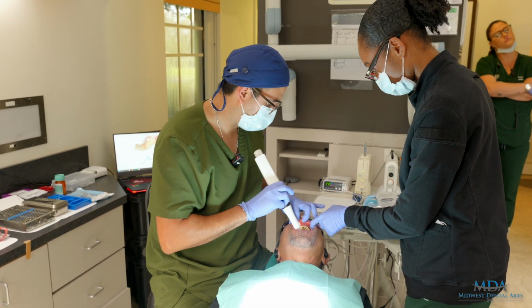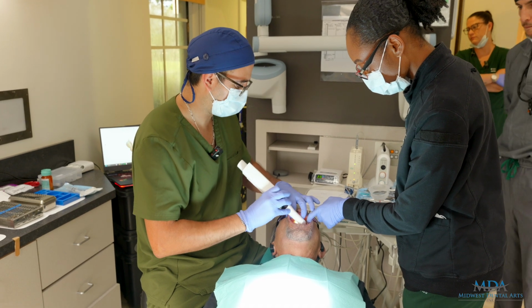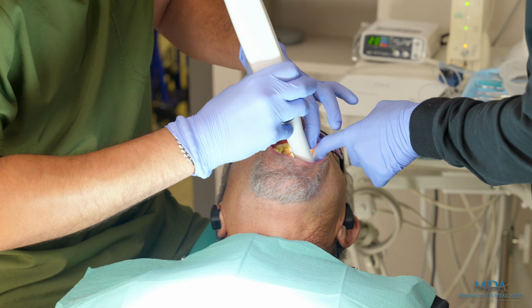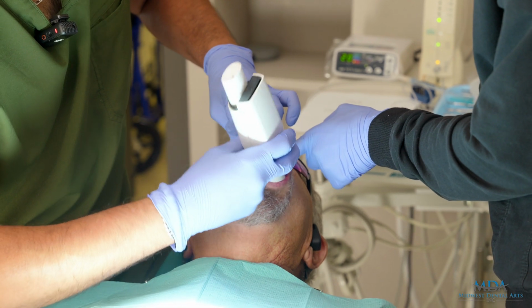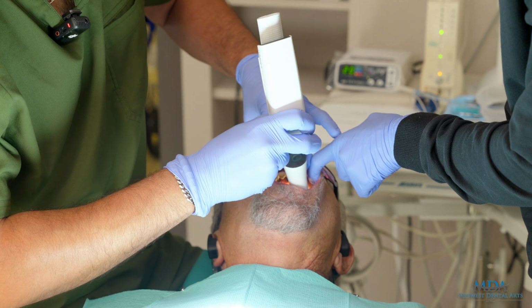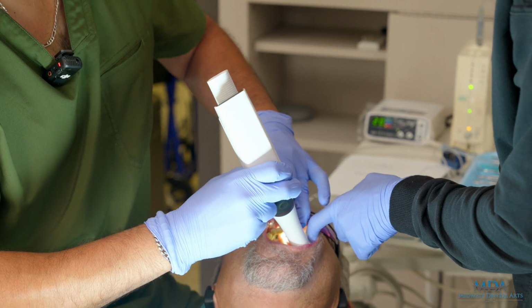When you get to the canine, you always want to do a kind of a rotating motion just to capture that buccal and palatal part of the tooth. Once you pass that canine, you can go back to occlusal and always go as far back as you can. Then you come on the forward. You see how it stopped? I'm not looking at the screen because I can hear the machine when it's not capturing something. So I can go back to a place that I know it records, and then I can use it.